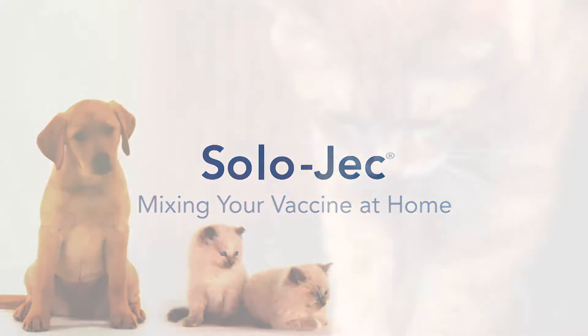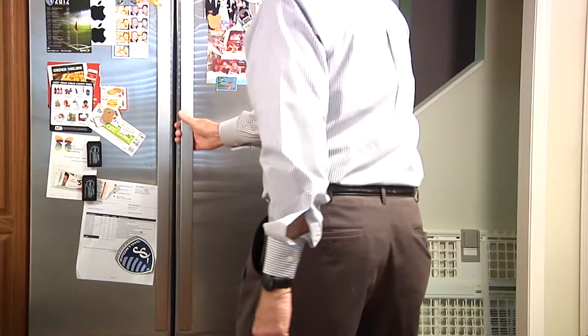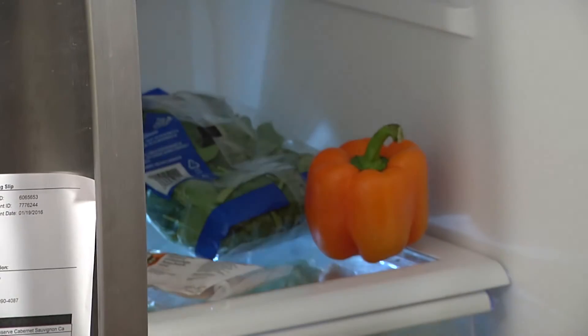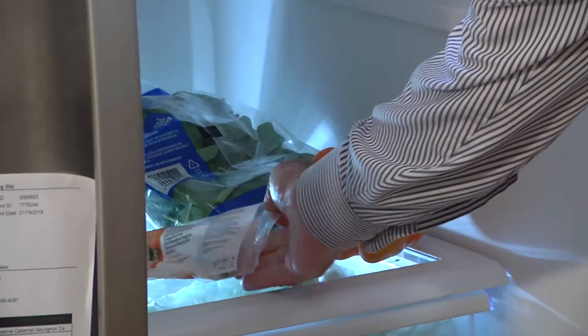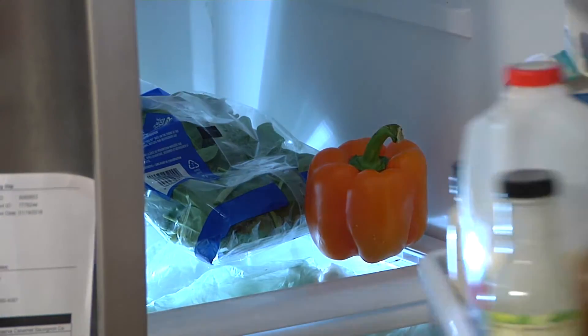Vaccinating your pet at home is as easy as 1-2-3. It starts with the proper storage of the vaccine in your refrigerator. When you're ready, remove the vaccine from the refrigerator and administer it to your pet within 30 minutes.